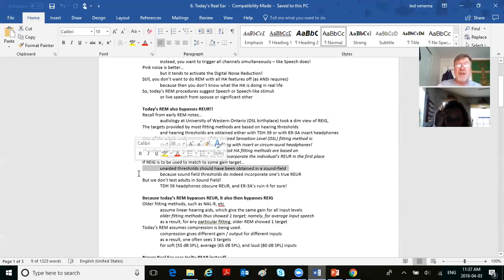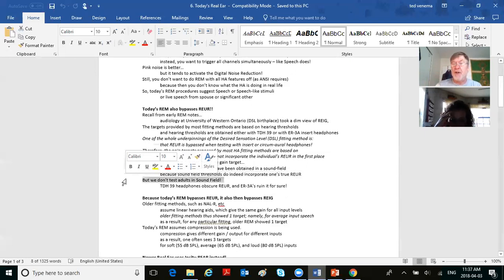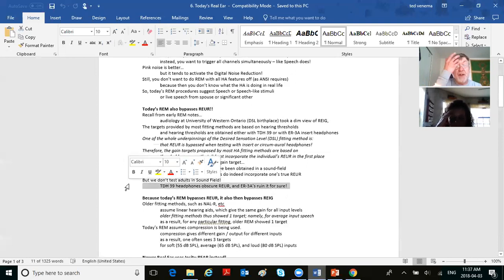Because only when you test in a sound field and you have no headphones on, only then do you have the open unaided ear canal, whereby you measure REUR. But we don't test adults in a sound field. Headphones obscure real ear response, and inserts ruin it for sure.